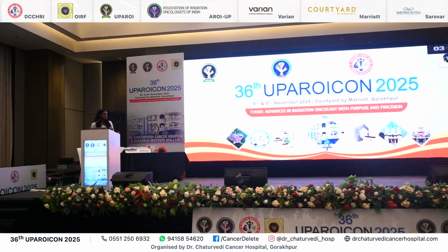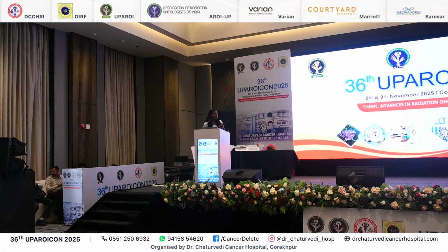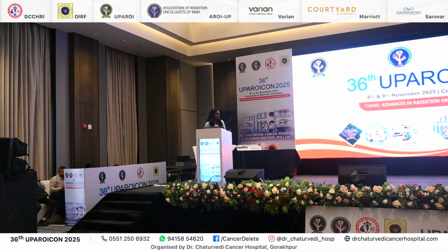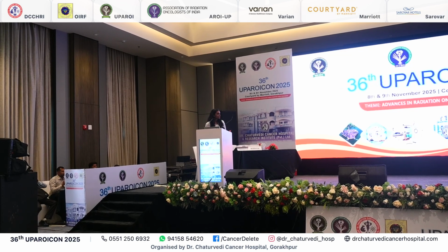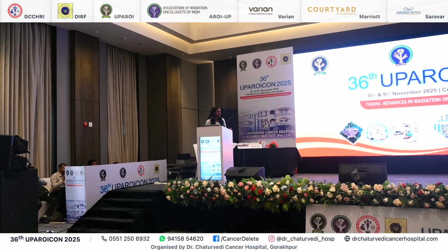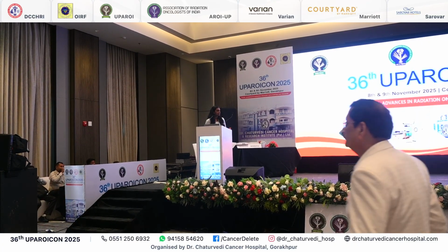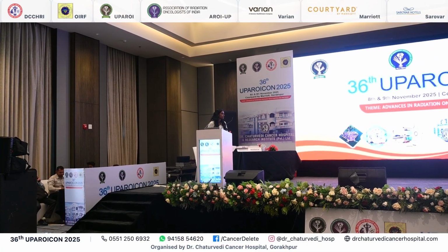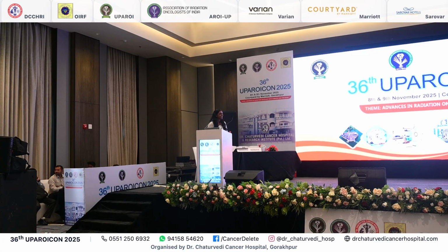Then it will be easier for us. If it is laterally or medially placed, the heart dose will be more. And one suggestion: when you show a dose distribution for any breast, it's always better to show an axial slice on the heart. The heart will give a dose distribution which is comparable between two techniques. This only shows you the lung, but not the heart. Because in left breast dose distribution we always have to look close to the heart to see what the heart dose is. No dose to the heart is recommended, but still we will have some dose to the heart.